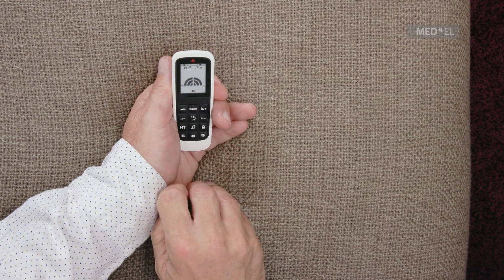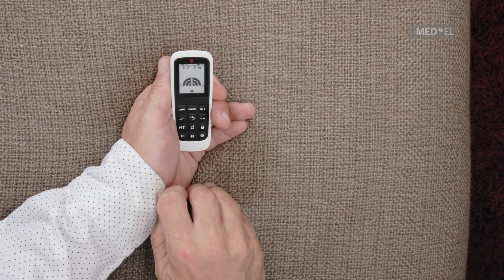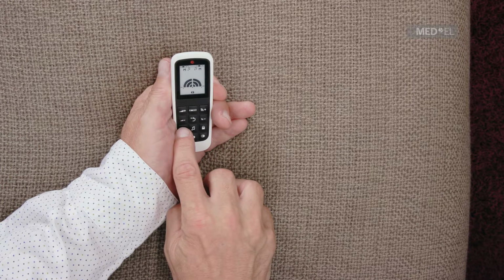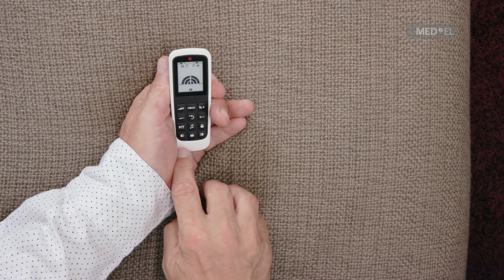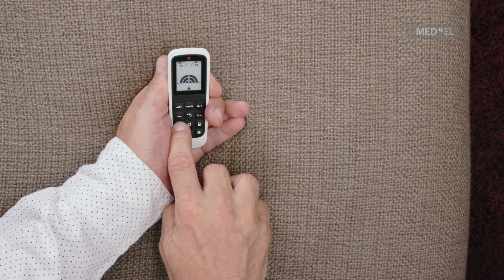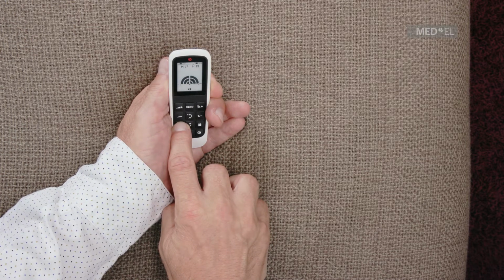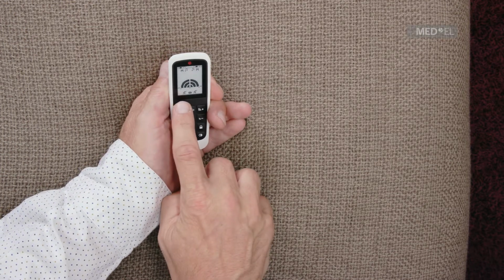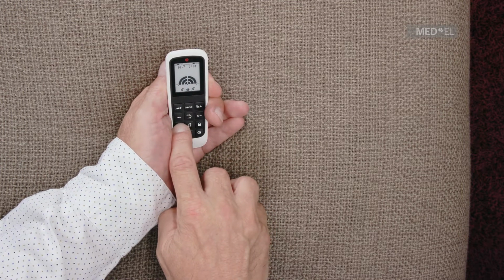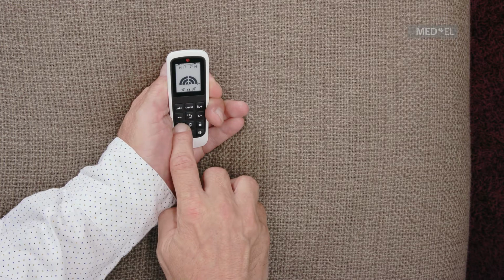To switch between hearing sound from your microphones, telecoil, or microphones and telecoil, press the MT button. To mute your microphones, press and hold the MT button for 3 seconds until the mute symbol is displayed. To unmute, press the MT button for 3 seconds again.